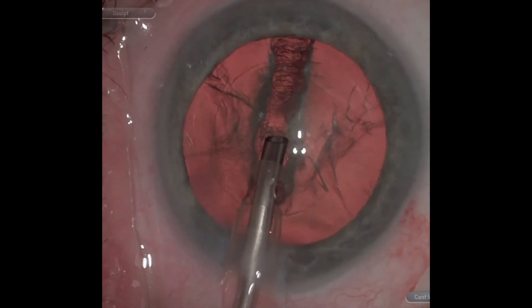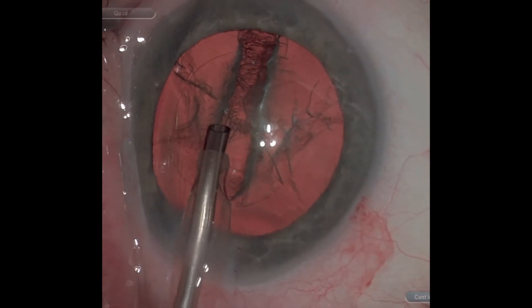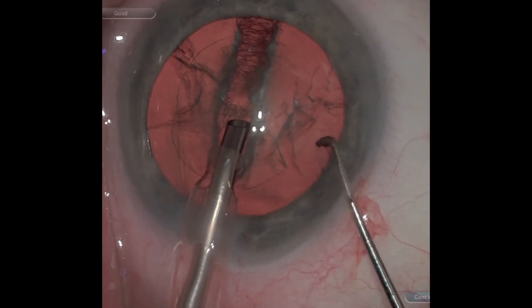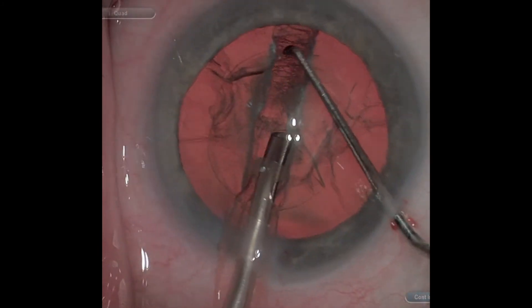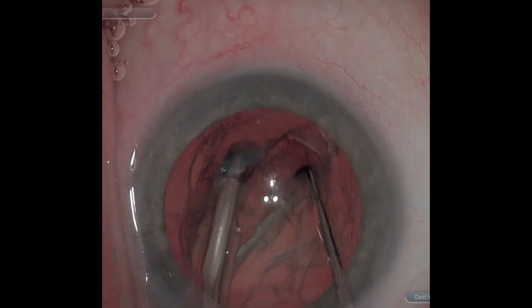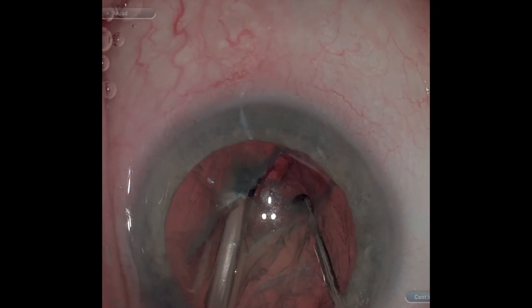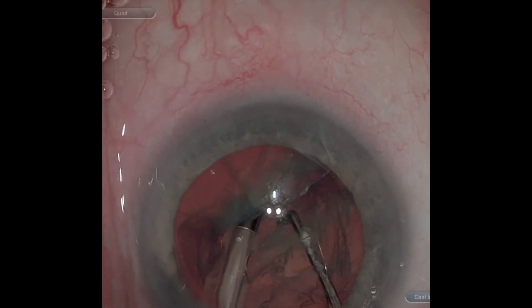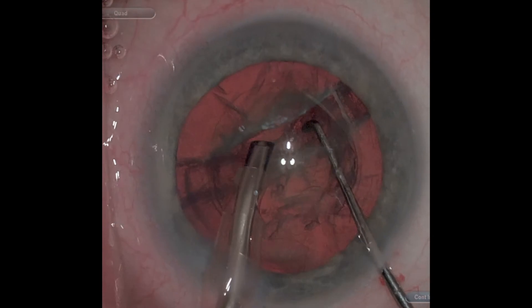Once the groove is created, a second instrument is placed and we crack at the distal third—a good angle for your instruments to pull or push. You'll see I miss here; I wasn't deep enough. But with good visualization I can readjust, get that crack going, and then unzip from the distal third to the proximal area.